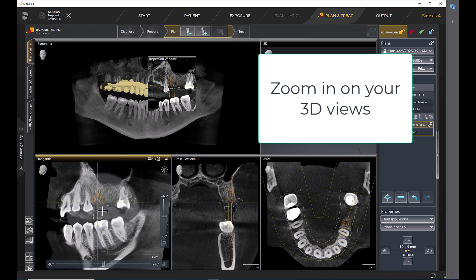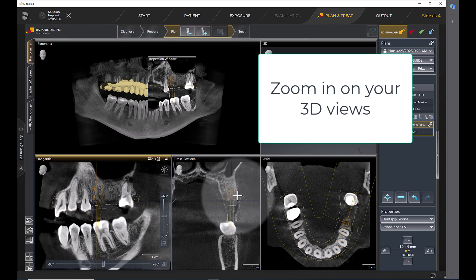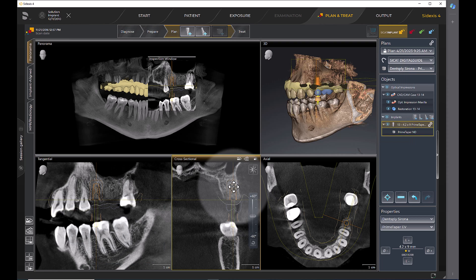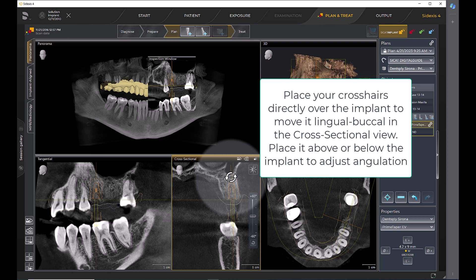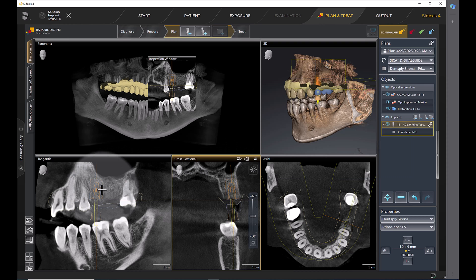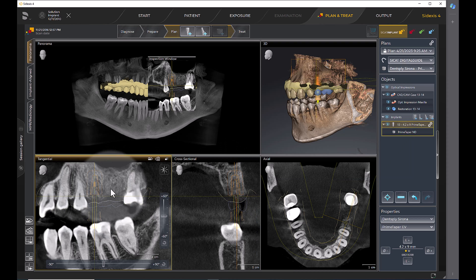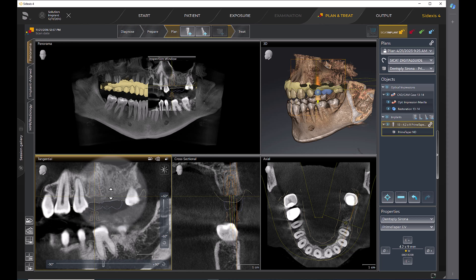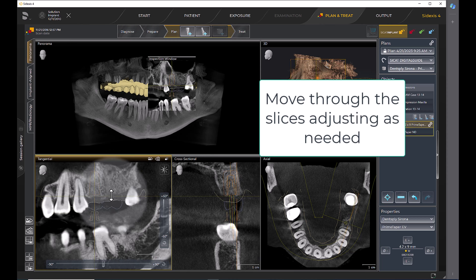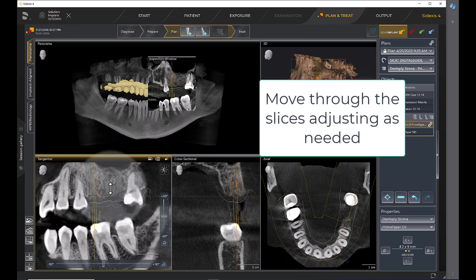Zoom in on your 3D views. Place your crosshairs directly over the implant to move it lingual or buccal in the cross-sectional view. Place it above or below the implant to adjust angulation. Move through the slices adjusting as needed.